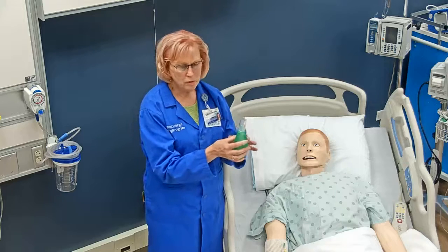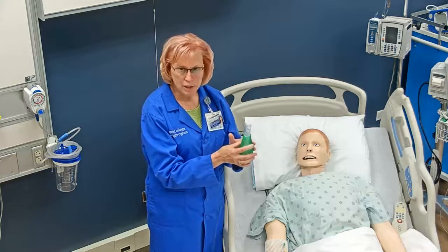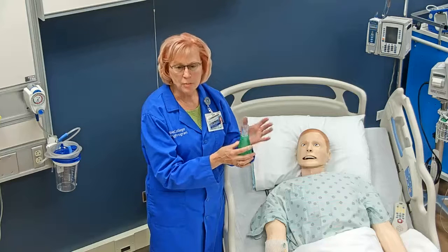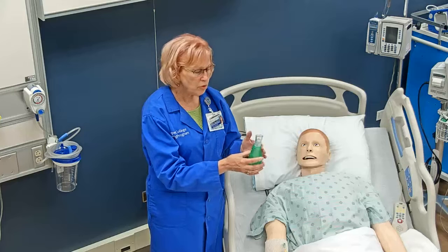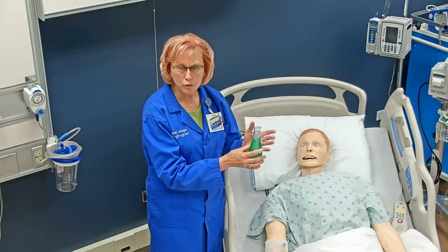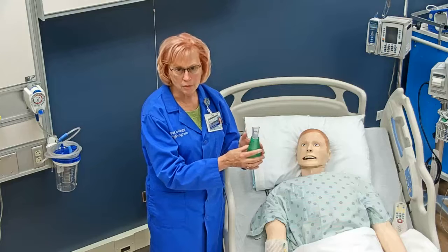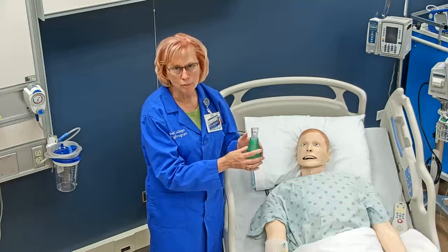The patient will do this about ten times and then cough. How often they do this per day is dependent on the prescription from the physician. Some will say to do it ten times every hour; others will say to do it ten times two or three times a day. It will depend on the patient's condition and on the prescription from the healthcare provider.